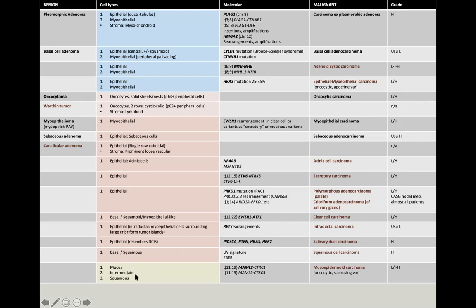Or do they have three, that unique one being mucoepidermoid carcinoma, with mucinous, so-called intermediate, and so-called squamous cells? Diagnostically, the number of cell types is helpful, as well as genetics. We now know a lot about the molecular genetics of salivary gland neoplasms, and in equivocal cases this can aid in subtyping, as each of these unique histologies has unique genetics in many cases, and we will talk about those as we go.